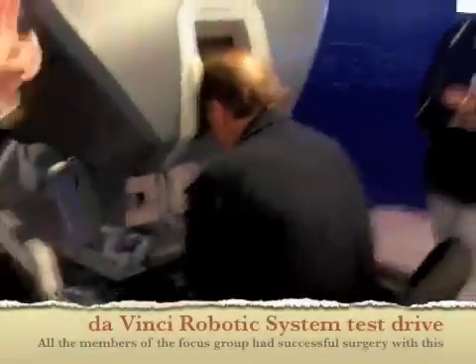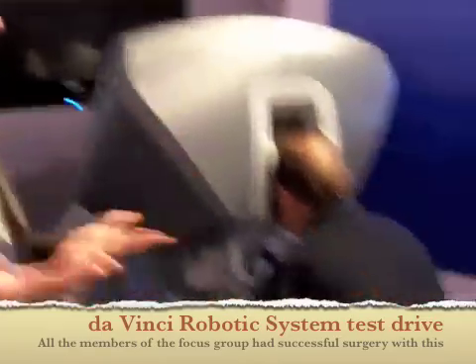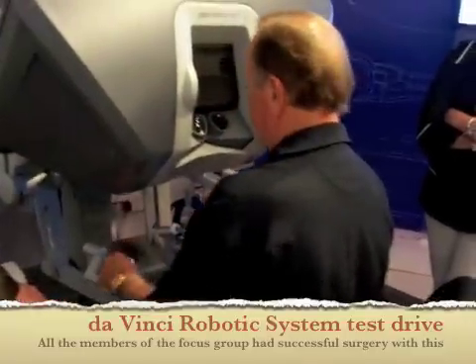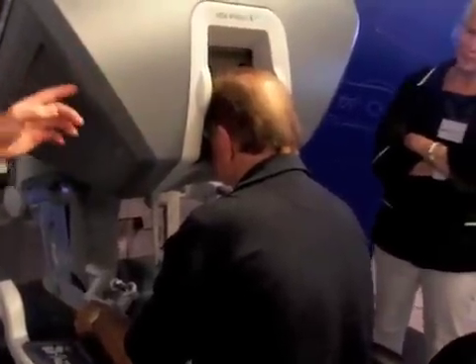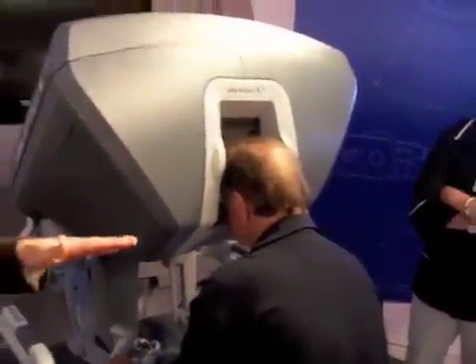There's really just two things you need to do. You have to be able to see it and you have to be able to use your hands to move the instruments. To see the image, you have to have your head inside of the viewer, because the system knows if your head's out and won't let you move the instruments for safety.